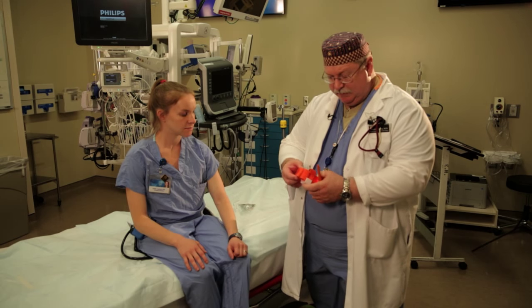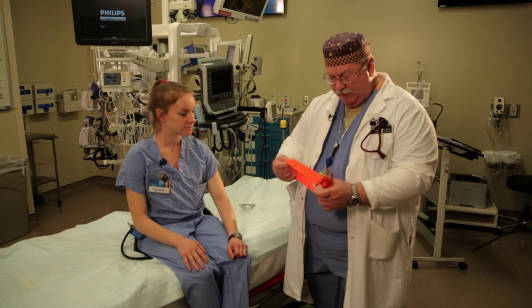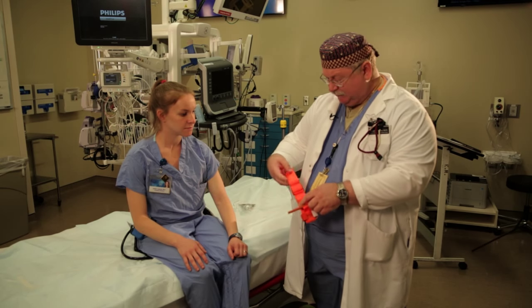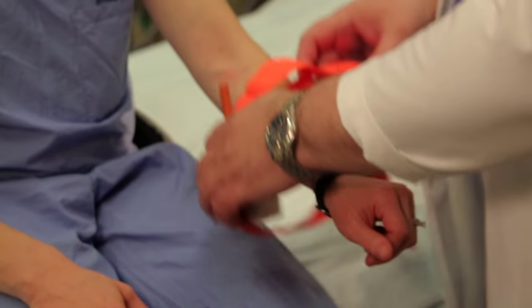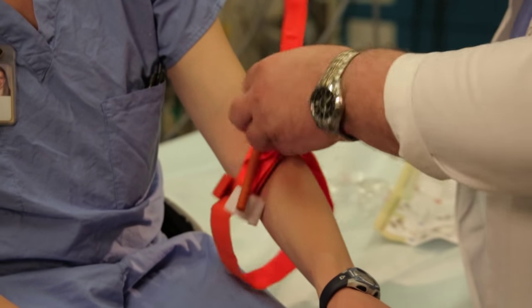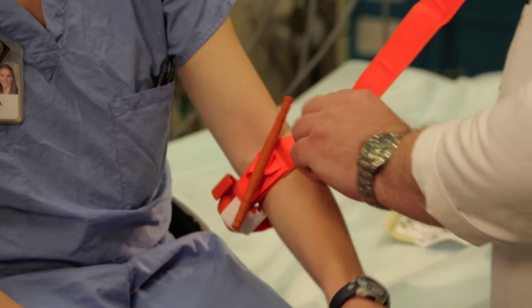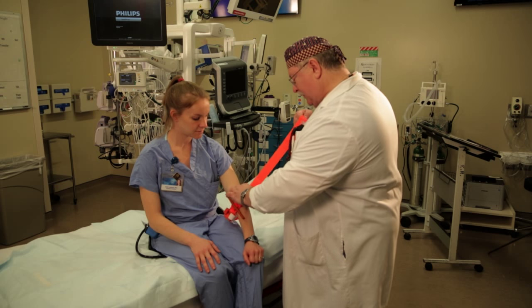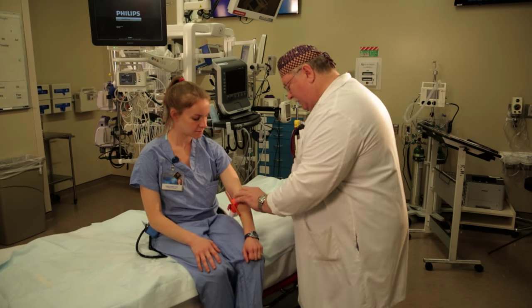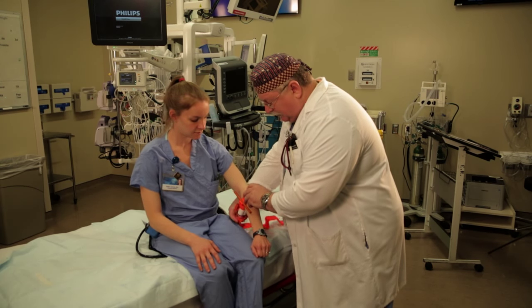There are a lot of counterfeit tourniquets out there that don't really work very well at all, and we don't want to use those kinds of tourniquets in this situation. So what we'll do is we'll place this tourniquet around the limb, loosen up this Velcro strap here, and tighten this down as best we can above the level of the wound. Then we're going to secure this Velcro on here like so.